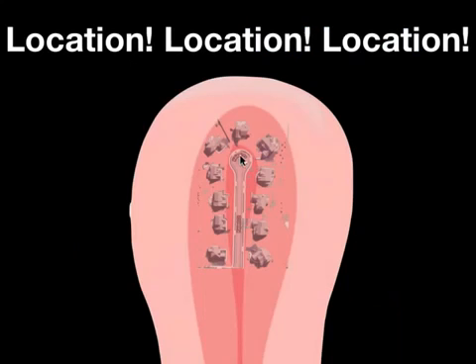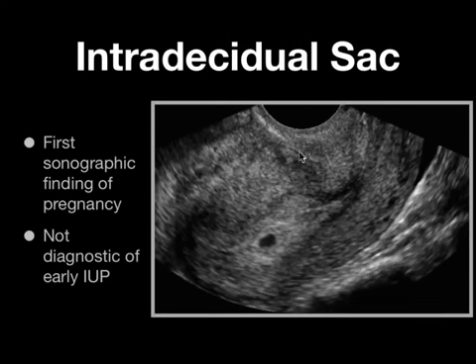And here you can see endometrial stripe, that's the road. Here's the endometrium. Here's where the houses are. They're not out here in the myometrium. They're not very close to the edge here. And you'll see in a little bit as to why that's important. But really take a look at where the pregnancy is implanted, because that's a key thing to understand and to look for.